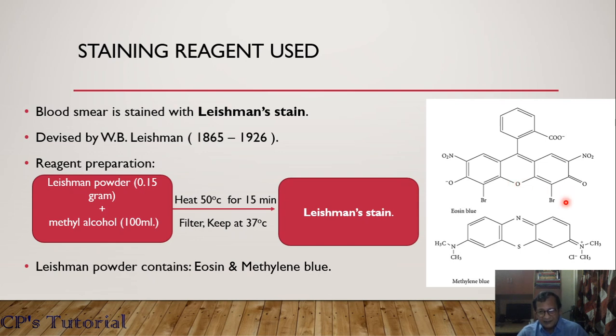Due to these different characteristics, when it stains a cell, the staining proceeds at a differential diffusion rate. Due to this diffusion rate, they migrate to the cellular components in different times.